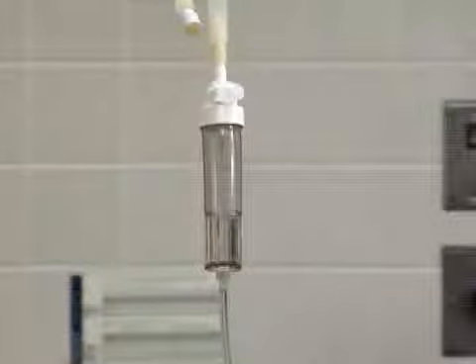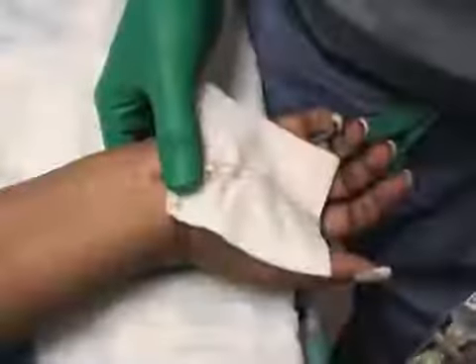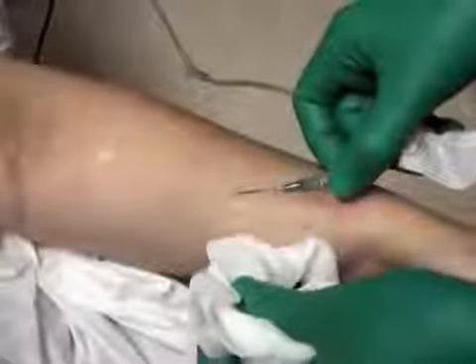Ensure proper and adequate fluid administration or flush the site with saline to prevent the more serious complications of thrombosis and embolism. An attempt should also be made to prevent IV fluid bags from becoming empty, which may cause cannula obstruction from blood clots or the infusion of air. If fluid extravasation or thrombosis occurs, remove the cannula immediately and place a new line if needed.